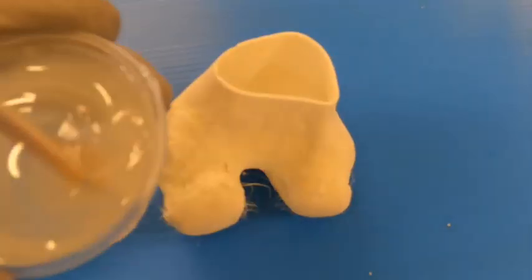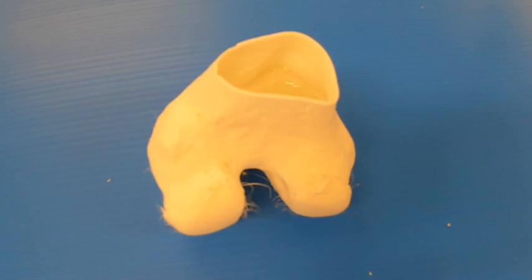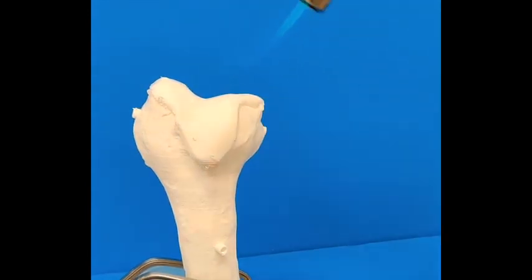To model cancellous bone, 15 milliliters of a two-part rigid water-blown foam was mixed two-to-one parts by weight, poured into the hollow bone cavity, and left for 20 minutes to set. It was then cut flush with the end of the model and left to cure for two hours. Rapid movements of the blowtorch were then performed over the TPU surface to achieve a smooth condyle finish. The rigid foam aids in shape preservation of the cortical bone during the cartilage smoothing process and provides manual feedback as well as anchor fixation similar to cancellous bone.